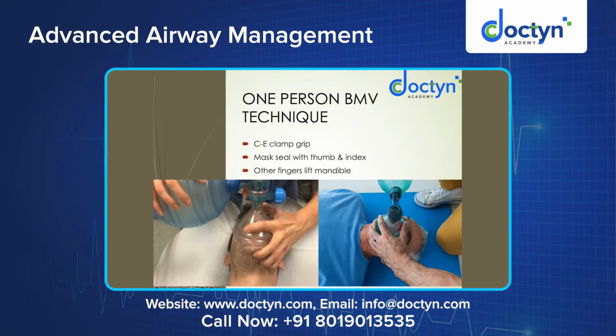So what is E? The three fingers support the mandible and lift the jaw so that the airway gets opened up. With the E clamp, we support the mandible, opening up the airway, and the C clamp approximates the mask so that an adequate seal is established. So this leads to provision of effective bag mask ventilation.